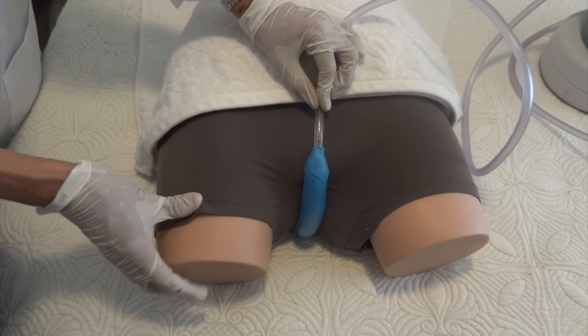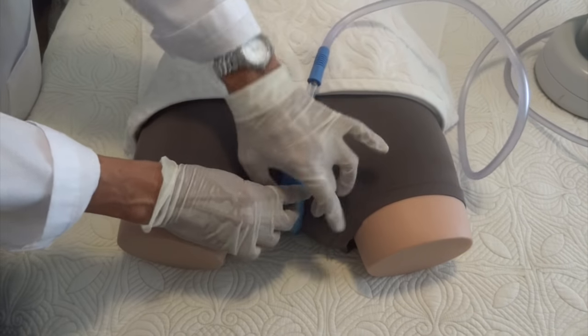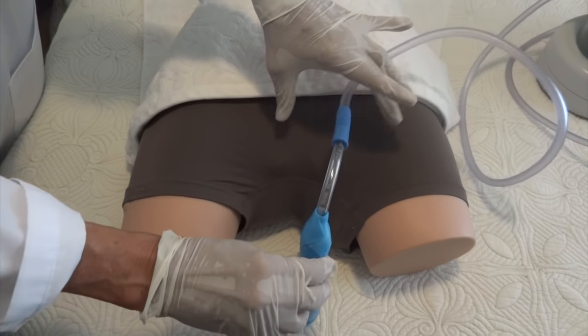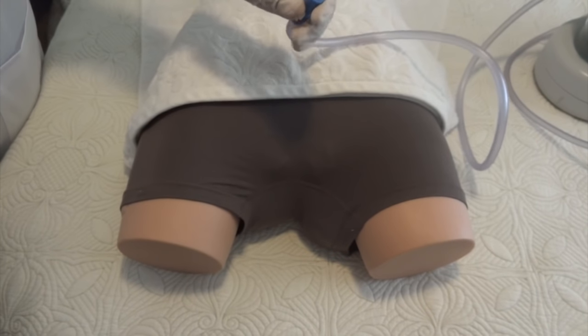When it's time to remove the wick, you again separate the legs, gluteus, and labia, and remove the wick. You can separate the wick from the tubing and dispose of the wick.